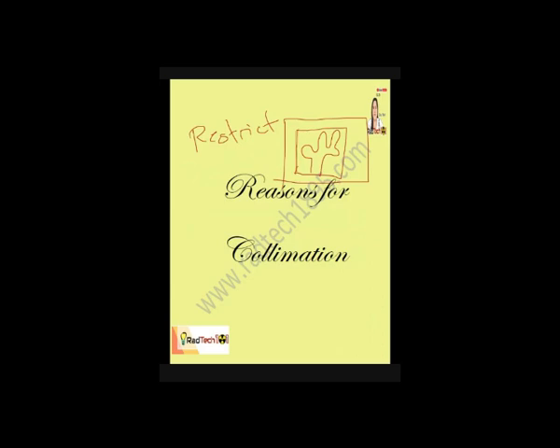Or halimbawa, yan yung structure natin, pero ang gusto lang nating kunin ay ito lang. Hindi lahat ay i-expose natin sa radiation. Instead, we will collimate only to this area. Yan lang. Or pwede pa siyang liitan. So, pwedeng ito lang. So, collimated lang. Yan lang yung ating i-expose sa radiation.